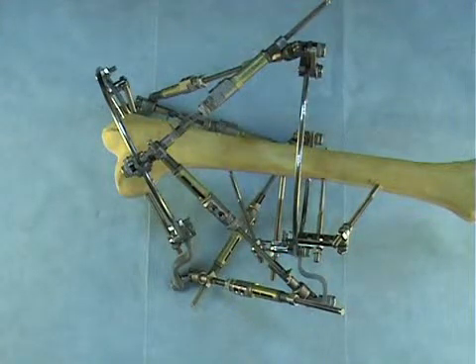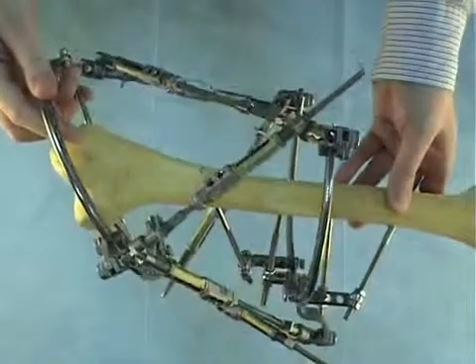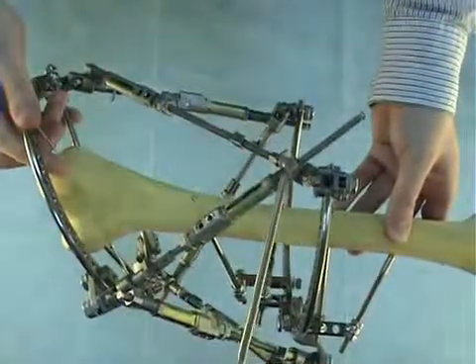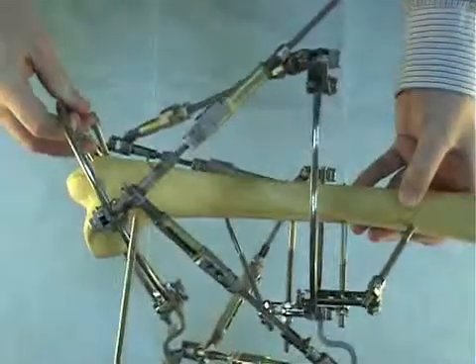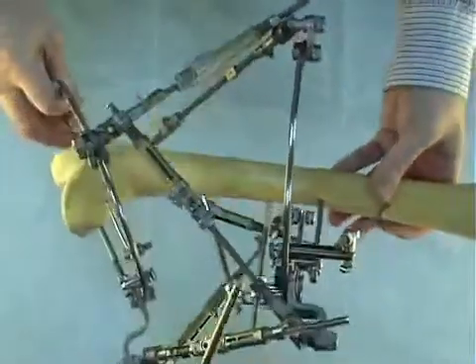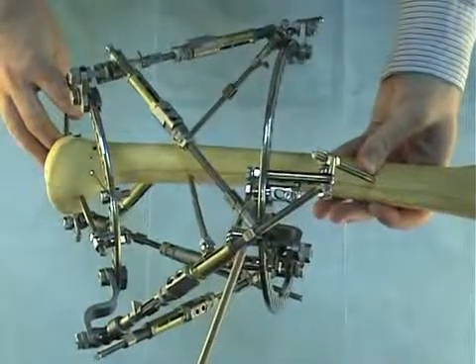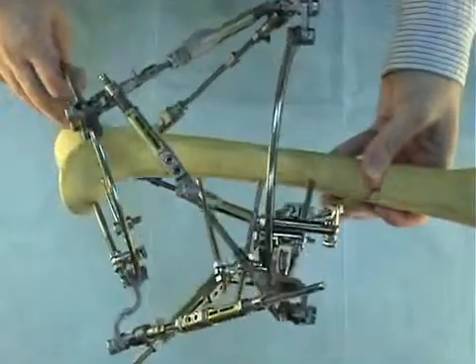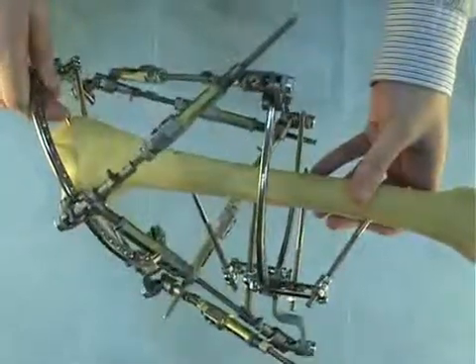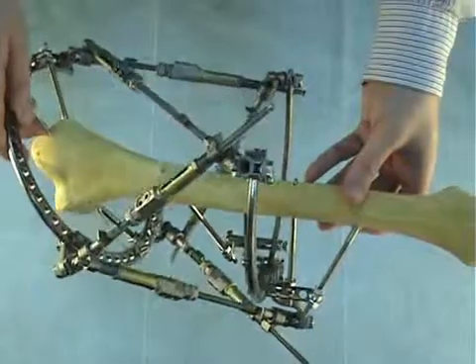Now the frame is assembled. You can see that we have attached the struts properly because we followed the logo rule. The SUV logo of strut number two is faced externally, and the same applies to struts number three, four, and all other struts. This confirms that our frame is made properly and it will work.